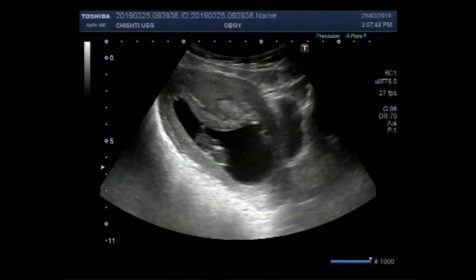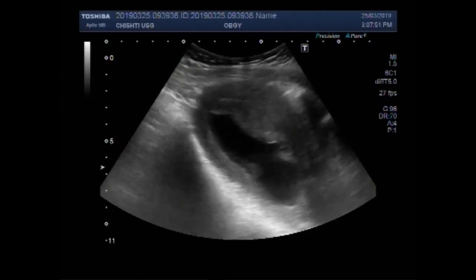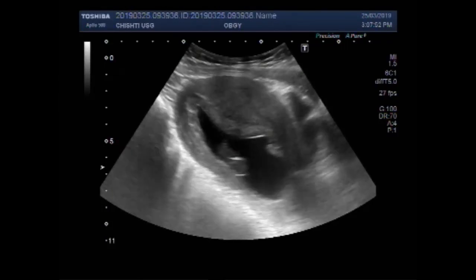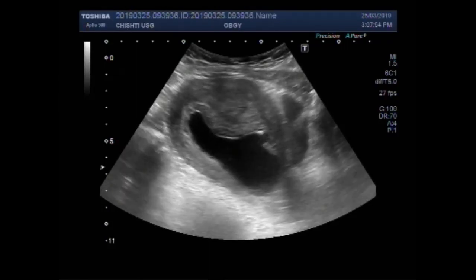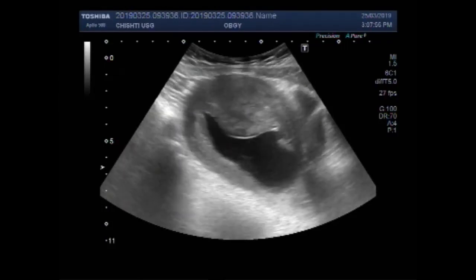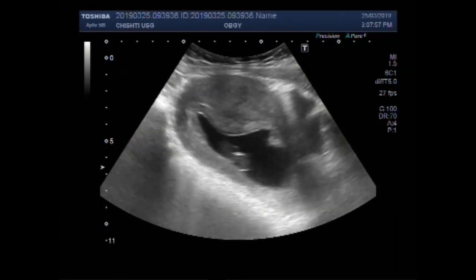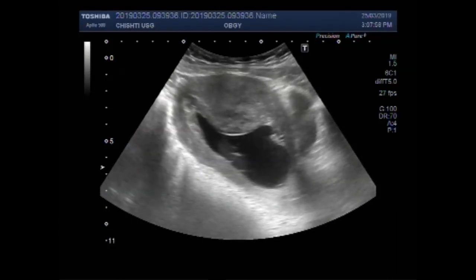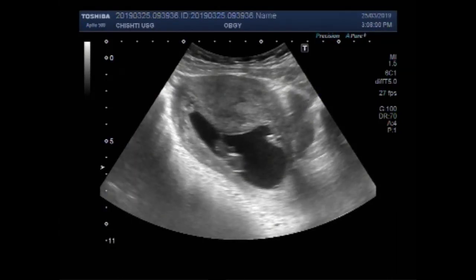Dear viewers, I hope you are all fine. This ultrasound video shows a case of missed miscarriage, or missed abortion.